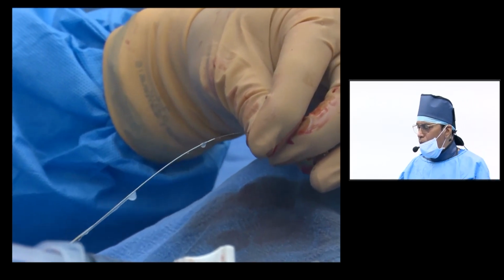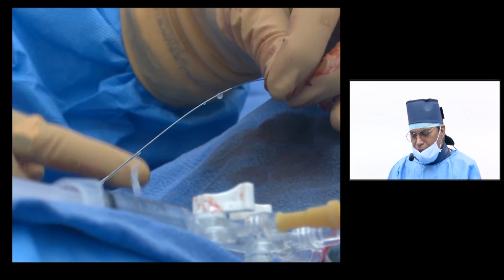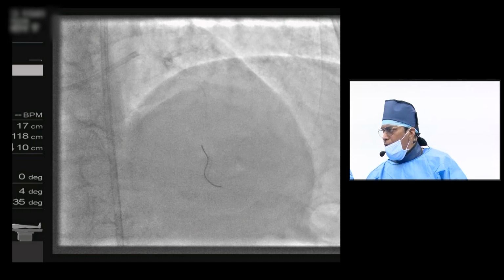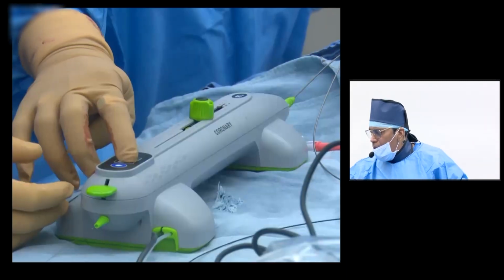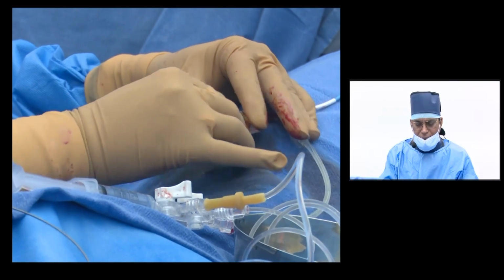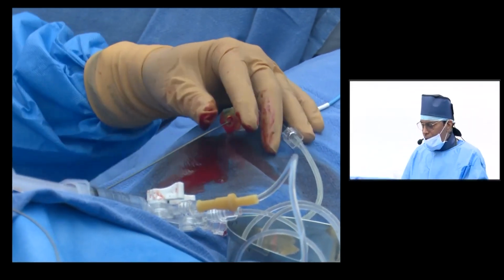Before you start orbital, you should always see the fluid come out of this hole. Then apply 80,000, 120,000, apply the advance knob and move it, and see whether it is moving freely or not. Similarly, we will activate 120,000. Now we have tested the orbital atherectomy. Once it enters the catheter, at that time activate the glide mode. Yeah, now you can activate the glide mode.